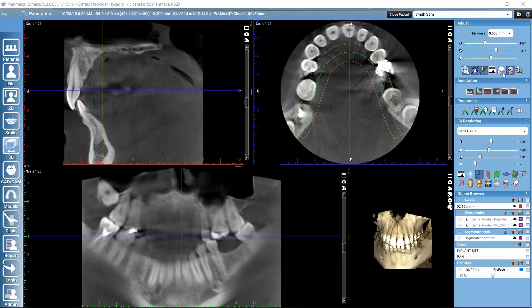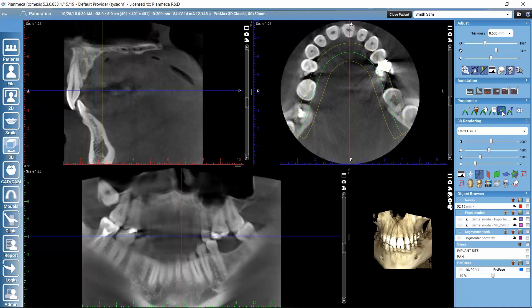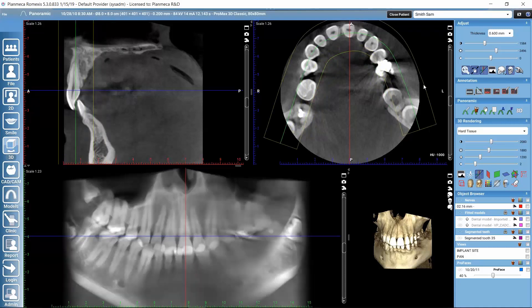Let's start by creating a panoramic view. We have here an automatic option — panoramic auto fit — that automatically places the panoramic curve in the view. Let's click here. This is a completely automatic function; it might depend a little bit on the volume and what kind of results we get. This is now the panoramic view generated based on the auto fit function.